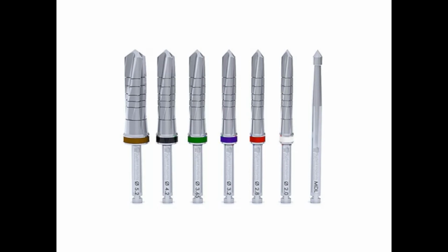Why is sequential drilling important? We have many reasons, like it reduces heat generation and allows correction of angulation of drilling after using the first drill.